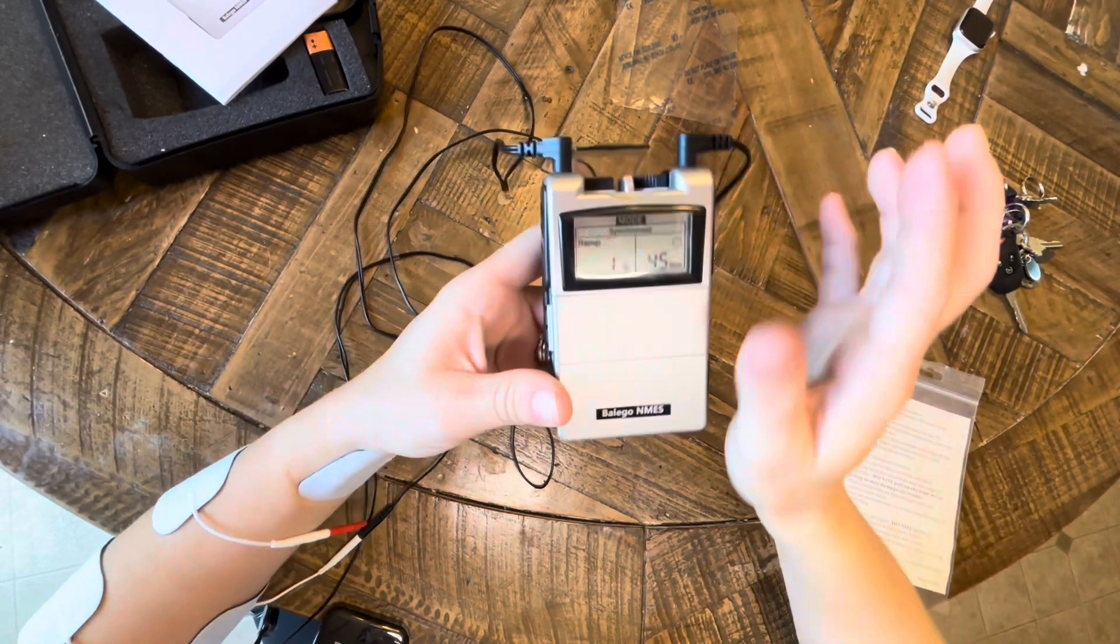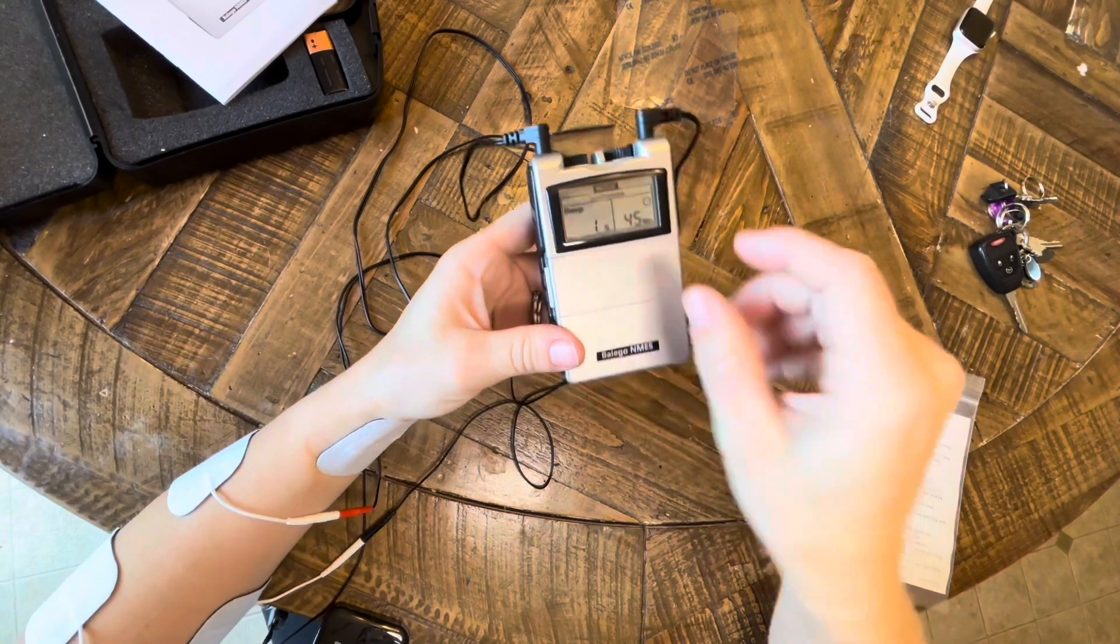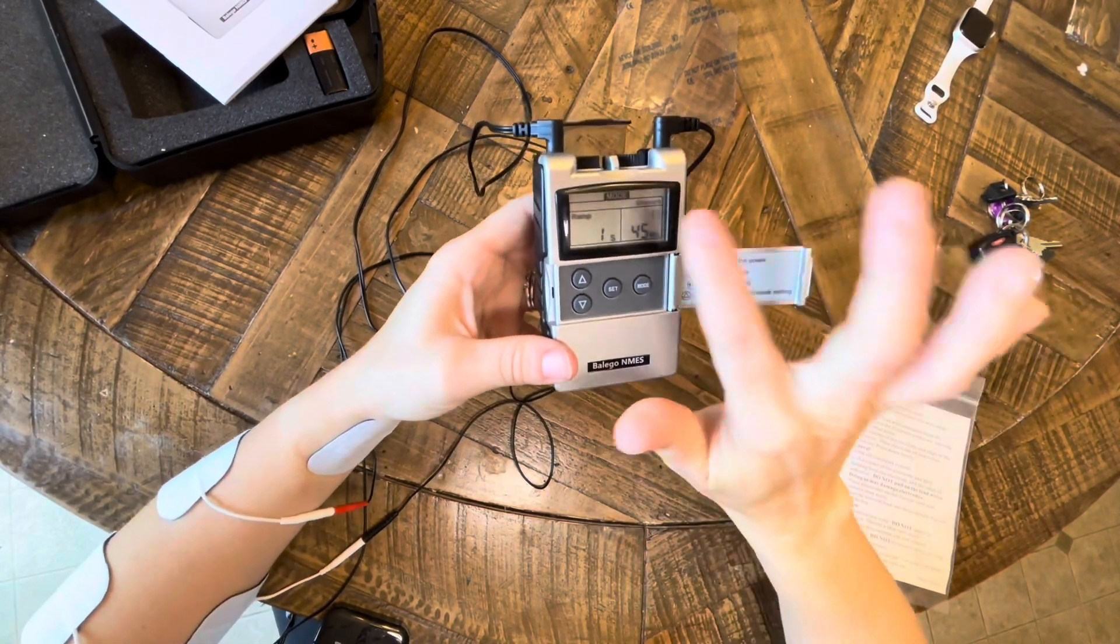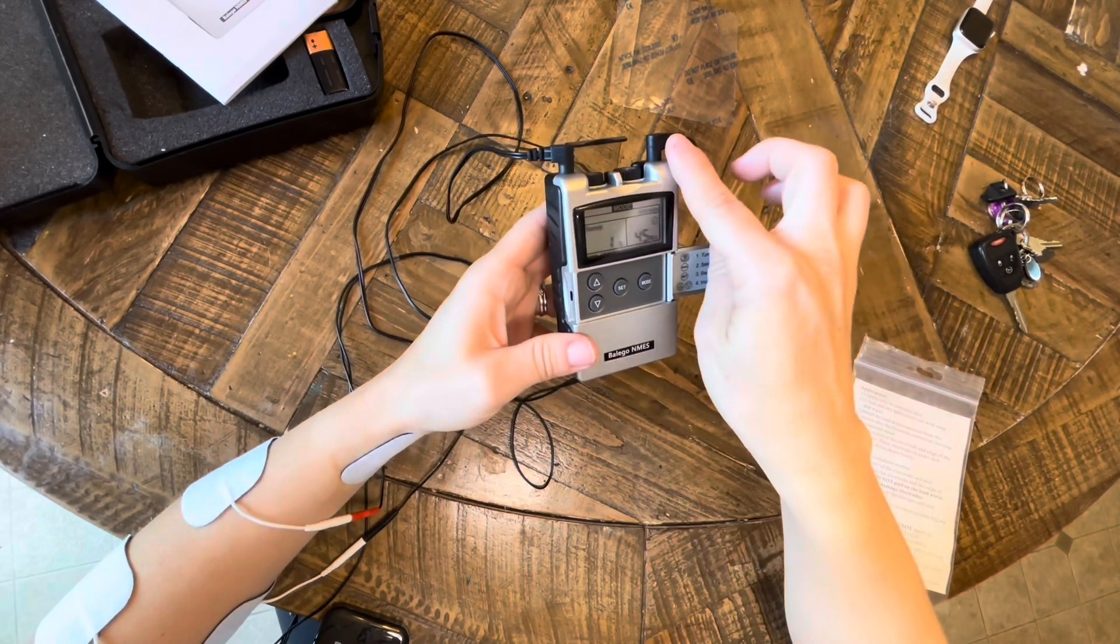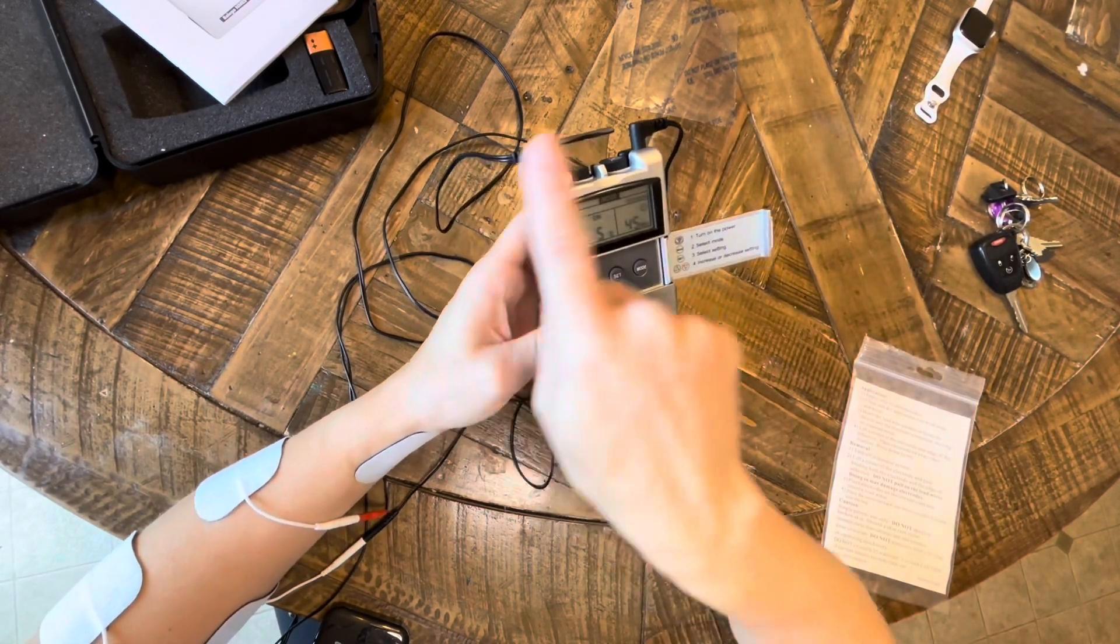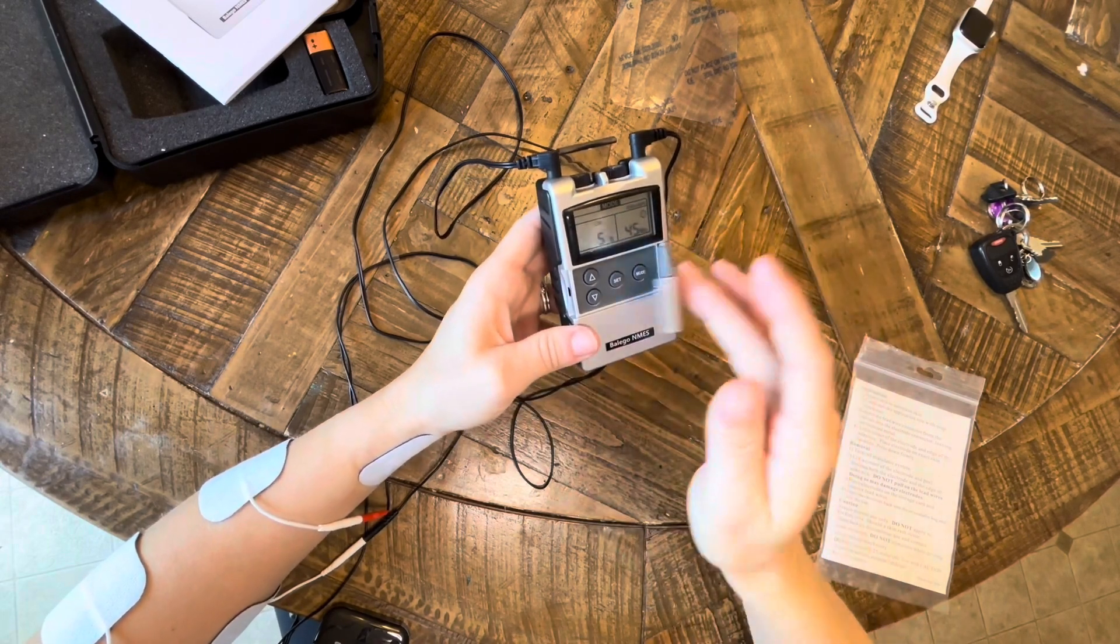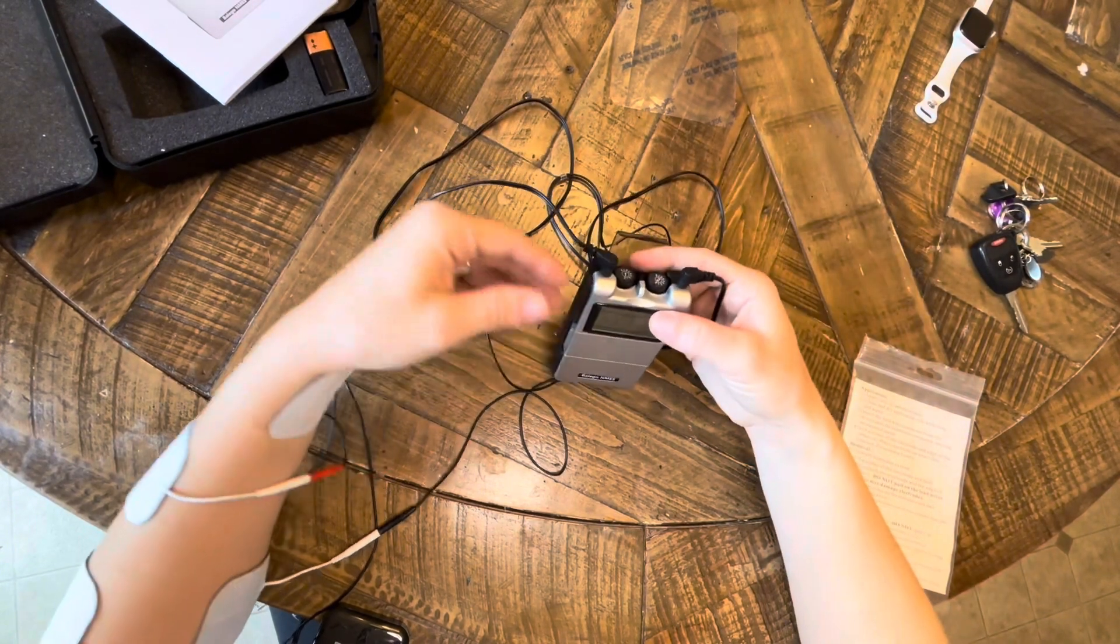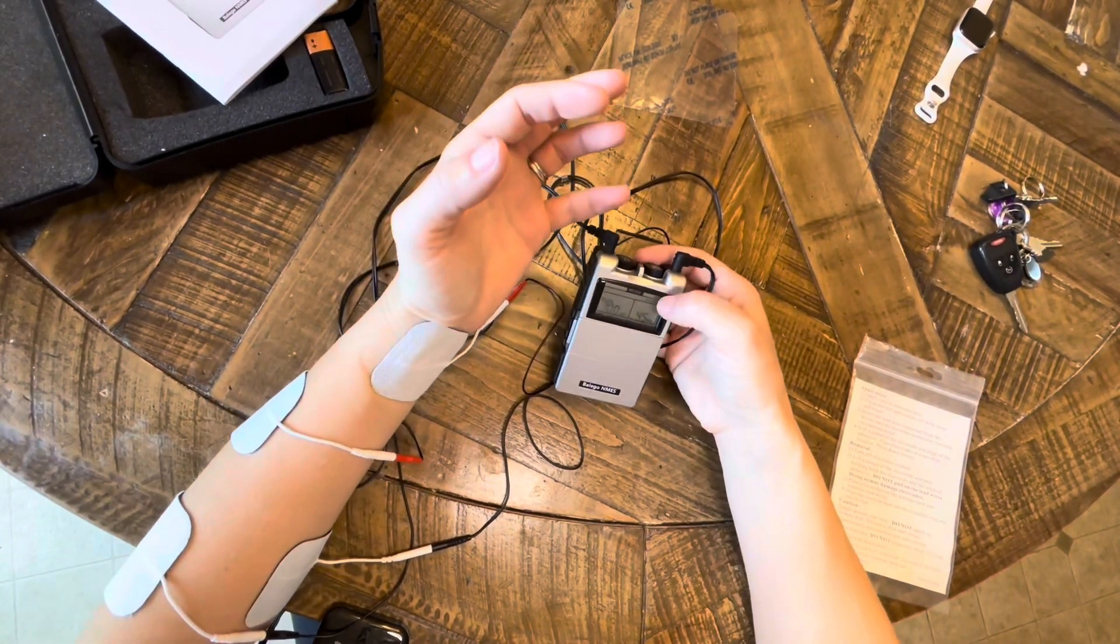So we'll turn on the Belego e-stim again. It was on synchronous mode and we need to change that. It needs to now be on alternate mode as we want the e-stim channels to alternate, going from flexors to extensors and back and forth, because now we are stimming the antagonist and the agonist.